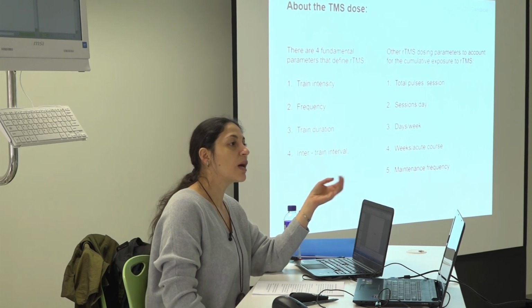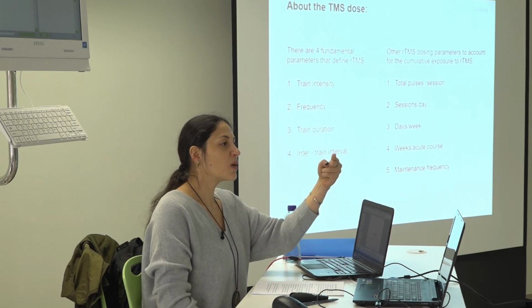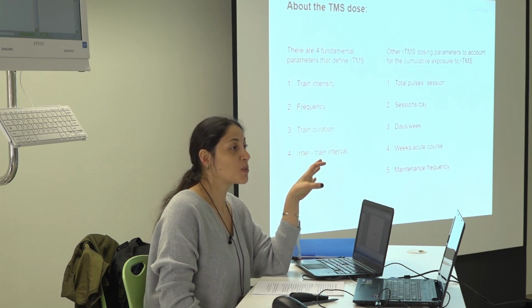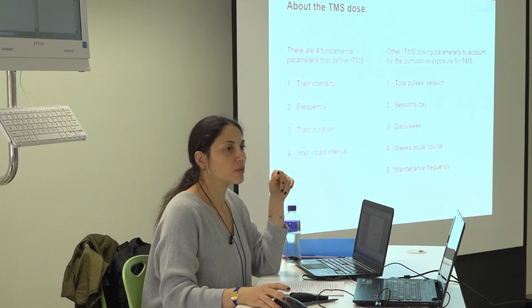And you want to reproduce that, but I recommend, when you are doing TMS and want to reproduce something, that you have an extra question that is probably behavioral and not related to TMS, because you never know if TMS will work. So always have a backup question in your hypothesis in a way that you make full use of all the experiments. And just get that paper, see which protocol they are using, and try to reproduce it here, which you can, because this machine does a lot of cool stuff.